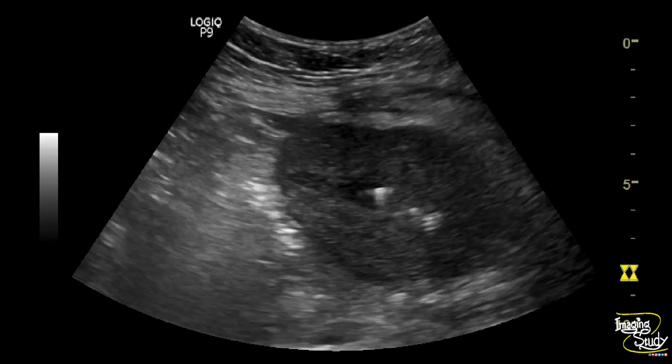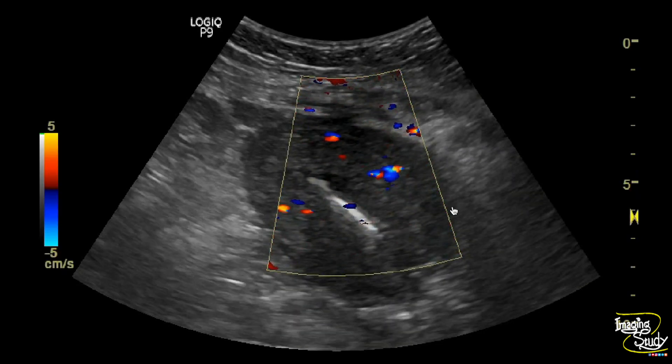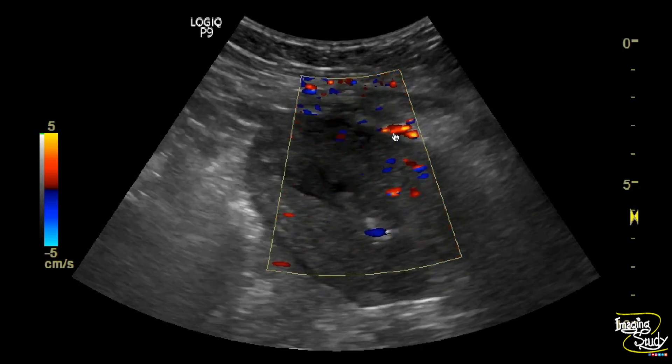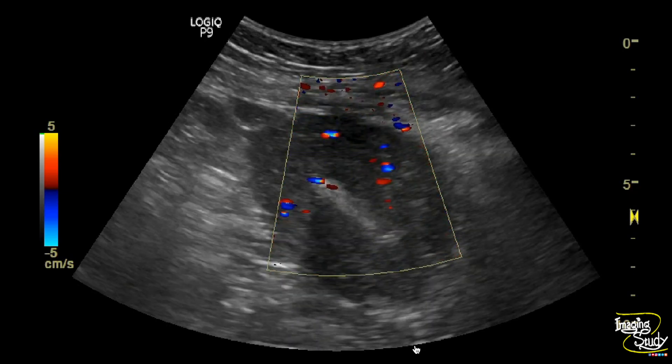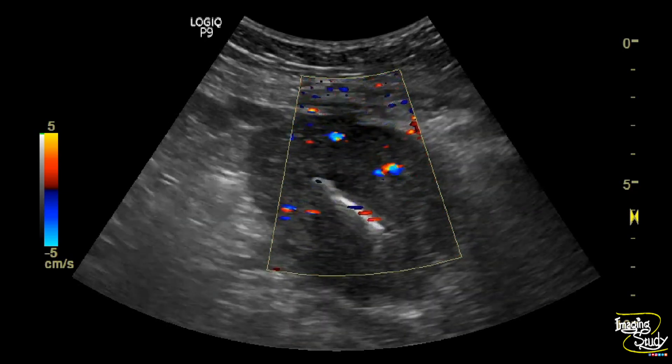With color Doppler, you can see increased vascularity towards the endometrium. There is some collection also within the endometrial cavity, which goes in favor of inflammatory change.